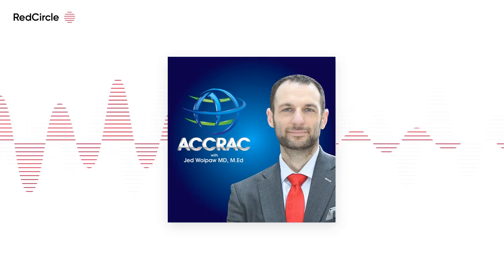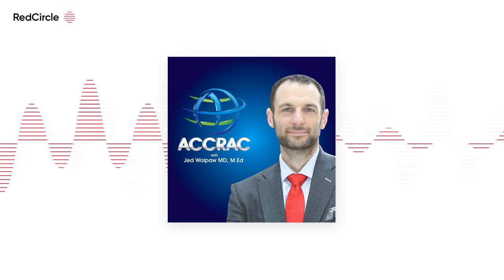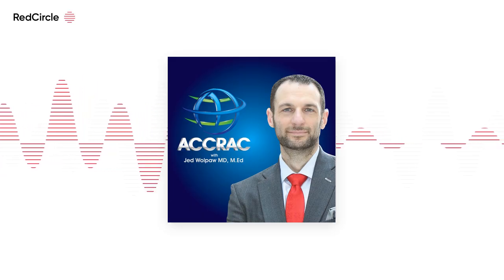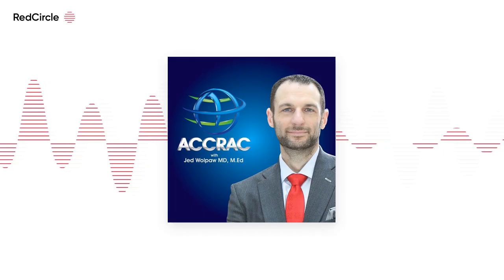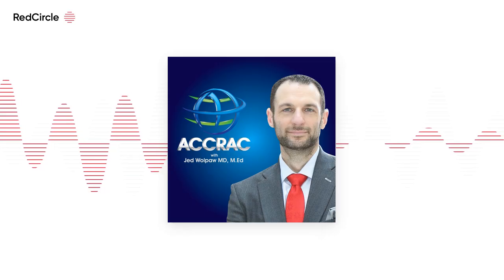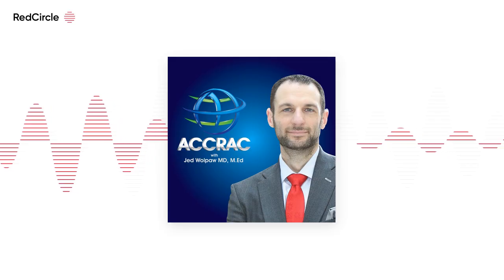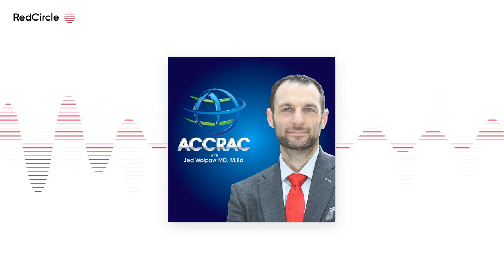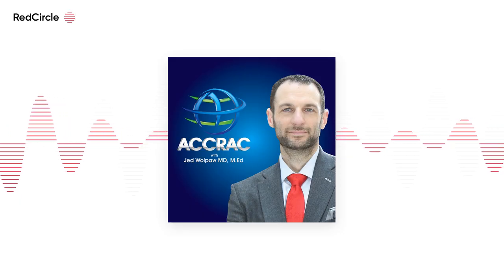Yeah, just compliance is a really confusing respiratory system mechanic. It's extremely important. It's the element behind driving pressure, which I'm sure we'll get into, but essentially tidal volume divided by respiratory system compliance gives you driving pressure. Mathematically, it's the same as plateau minus PEEP, which is the denominator in the mils per centimeter of water of compliance. But really it tells you the change in volume per unit change in pressure. So obviously a more compliant lung, when you add centimeters of water, it's going to add more volume to your patient.